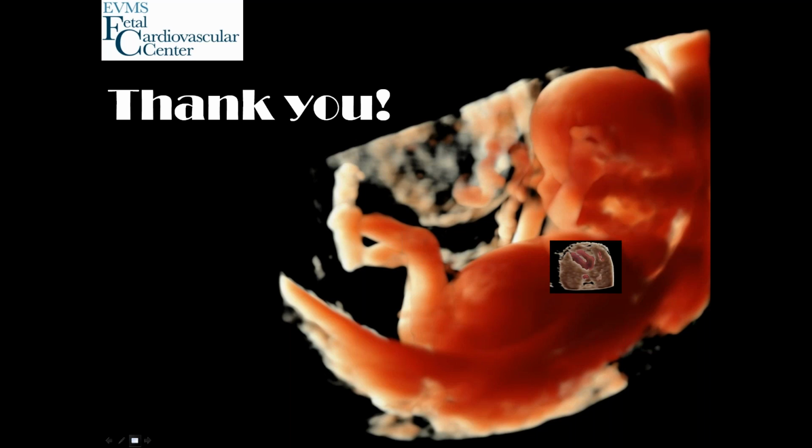So I would say that the transvaginal ultrasound is the most helpful at about 14-15 weeks gestation for detailed assessment. I also use this ultrasound approach earlier, especially if we need to make some diagnosis or decision earlier than 14 weeks and the patient insists. Also, transvaginal ultrasound for screening if you suspect something on transabdominal. So we always prefer to take a look transvaginally right away, just to make sure that your suspicion makes sense, to double check your suspicion.